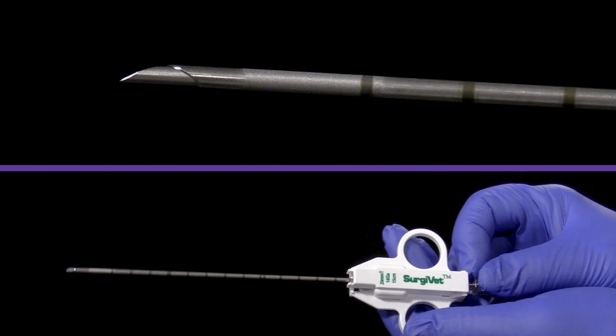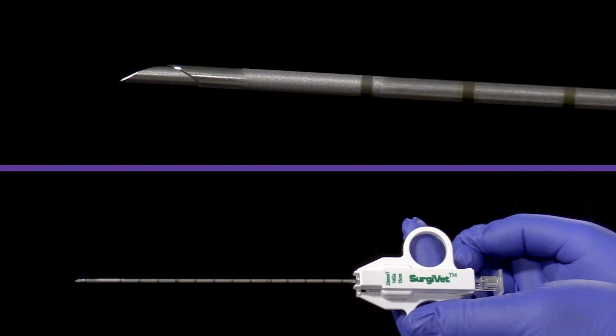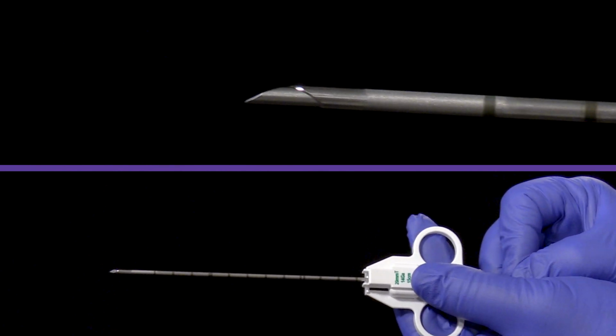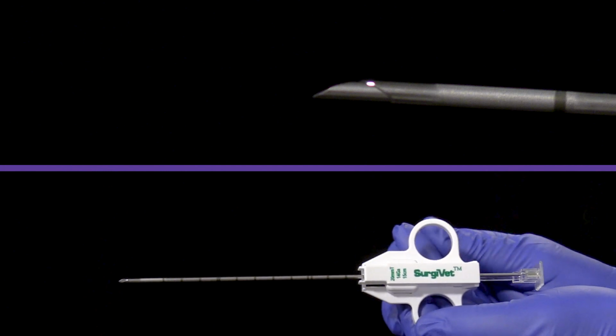Before you begin, familiarize yourself with the biopsy needle. First, pull back on the handle until you hear a click and it stays in place. This loads the needle for the biopsy procedure.